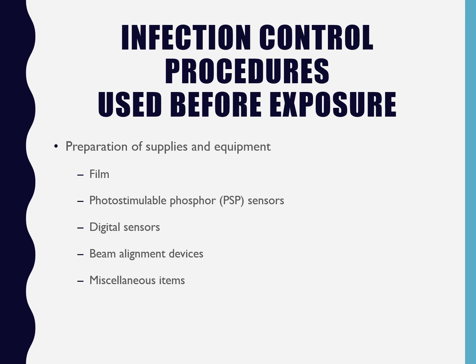And then I was trying to take an x-ray on a patient once, a panoramic, and I told him that he needed to remove any jewelry from the neck up. And he started taking off his belt for me because he thought that the metal on the belt was, and that was a little awkward. I was like, whoa, whoa, whoa. He was like, wait, there's metal on my belt. I'm like, yeah, this isn't an MRI. This is just from the collarbone up.